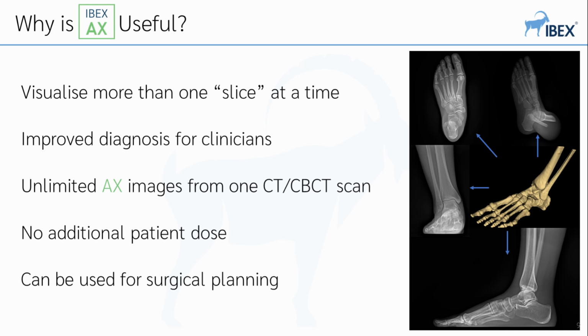However, bridging this gap between these two data modalities not only allows for supporting diagnoses, but also aids in the communication between clinicians specializing in 3D data and other clinicians within the healthcare community that may be less accustomed to using 3D volumetric data. Beyond this, AX can help clinicians communicate more clearly with their patients, an aspect of patient care which is becoming increasingly important. Patients can often find it difficult to fully understand volumetric 3D data, but are usually familiar with radiograph-like 2D images, and so IBEX AX bridges this gap in patient communication.